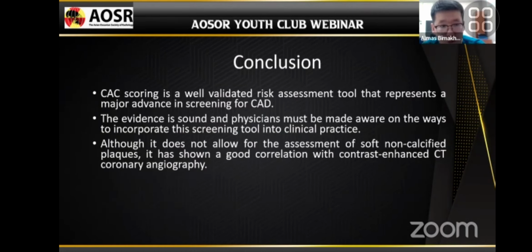So in conclusion, I want to say coronary artery calcium scoring is a well-validated risk assessment tool that represents a major advance in screening for coronary artery disease. The evidence is sound and physicians must be made aware on the ways to incorporate this screening tool into clinical practice. Although it doesn't allow for the assessment of soft non-calcified plaque, it has shown a good correlation with contrast enhanced CT coronary angiography.